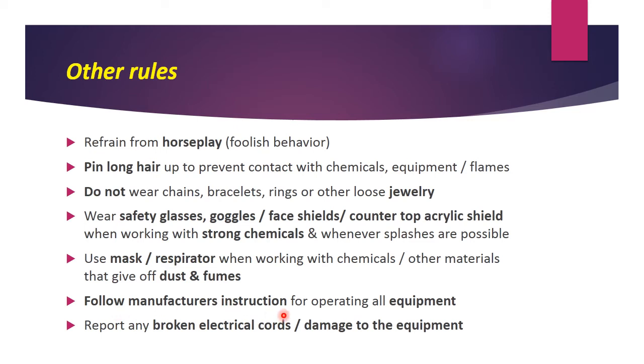Follow the manufacturer's instructions for operating all the equipment. So please follow all the instructions given by the manufacturer to run the equipment. Report any broken electrical cords or damage to the equipment. If any electrical cords or equipment have been damaged, it has to be reported to the head of the laboratory.